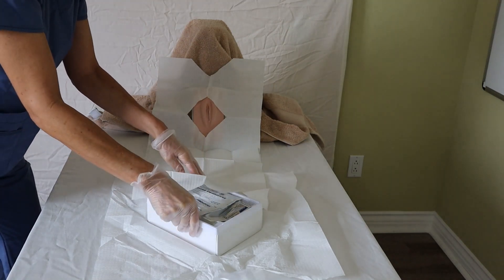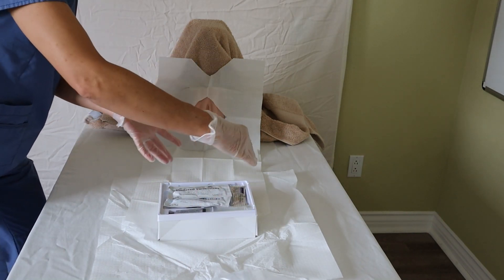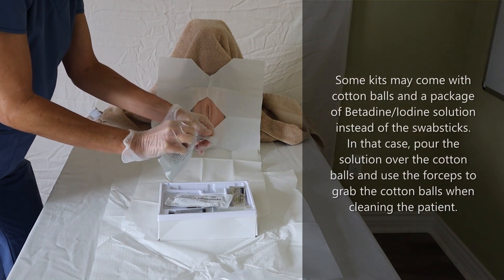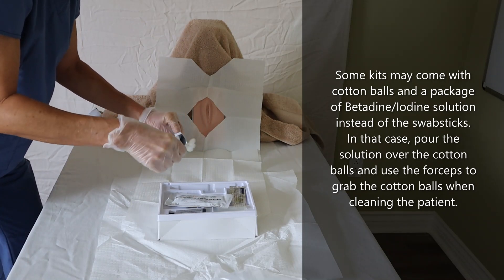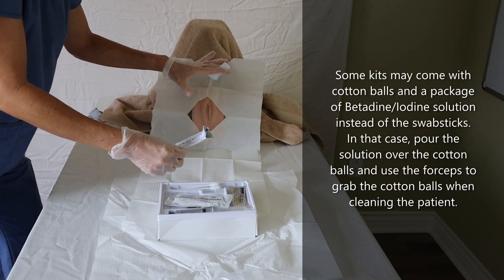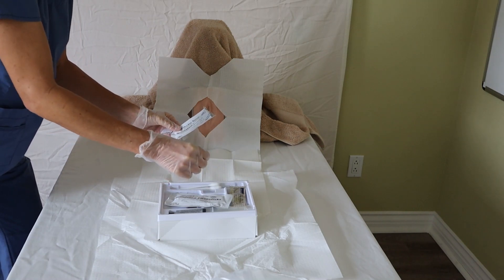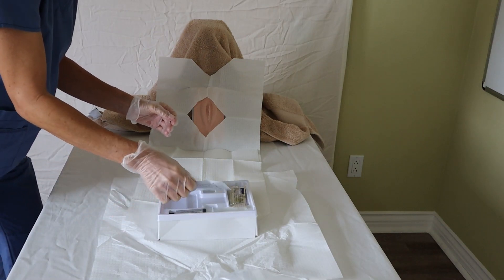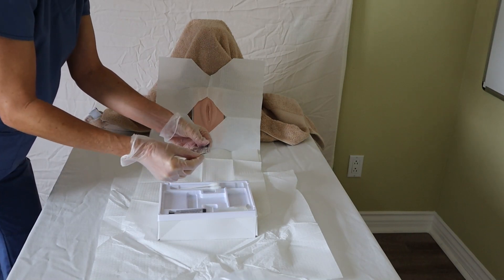I can touch the inside of the box because it is sterile, giving me a nice lane to work with. I have my swab sticks to clean the patient. I open them up and place them so that when I have one hand touching the patient and it's no longer sterile, I can just grab the swab sticks with my sterile hand, making it much easier. I also have my lubricant here.